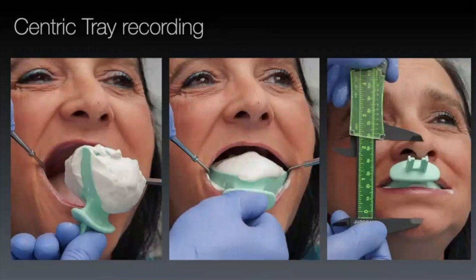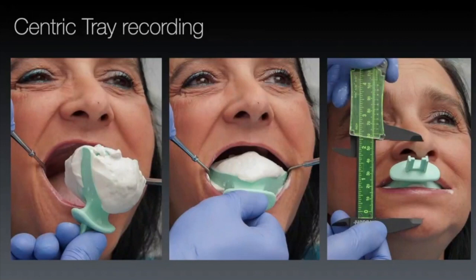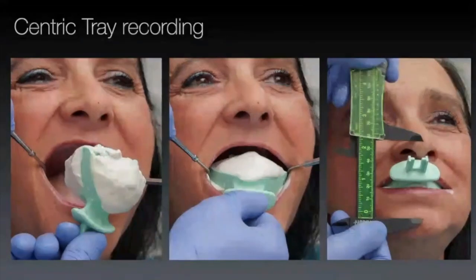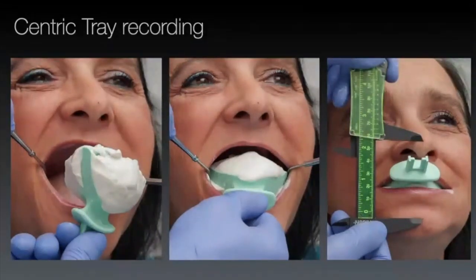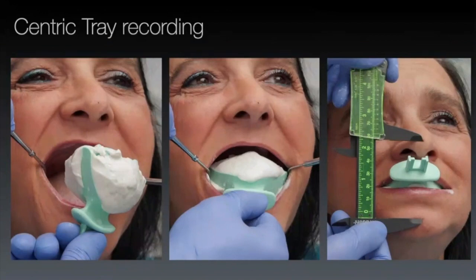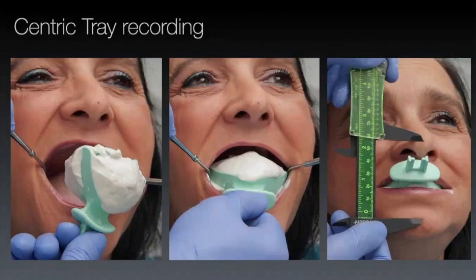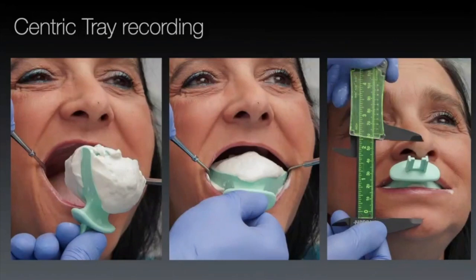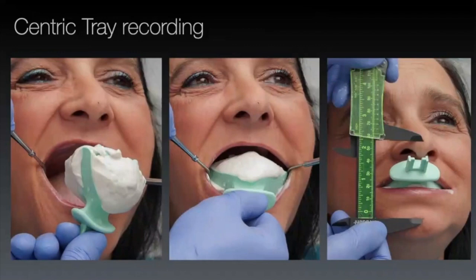The centric tray is like a boomerang with little handles. We load it with putty or heavy-bodied alginate, put it in the patient's mouth over the ridges, and get the patient to close. I get them to close back to 70mm — that way I'm not asking them to close into a closed OVD, which would cause them to protrude. Subtracting three millimeters gets me roughly to the closed-mouth OVD. I use this for partials too.